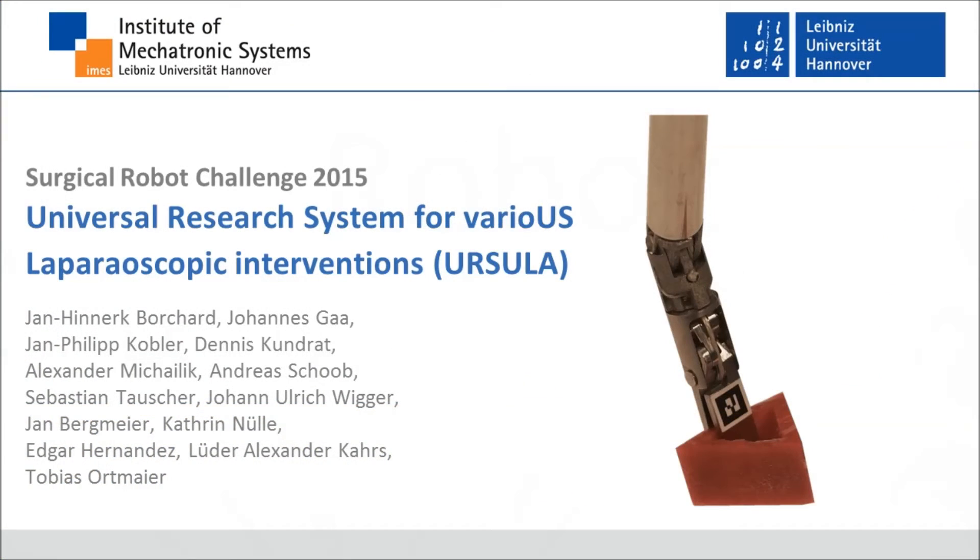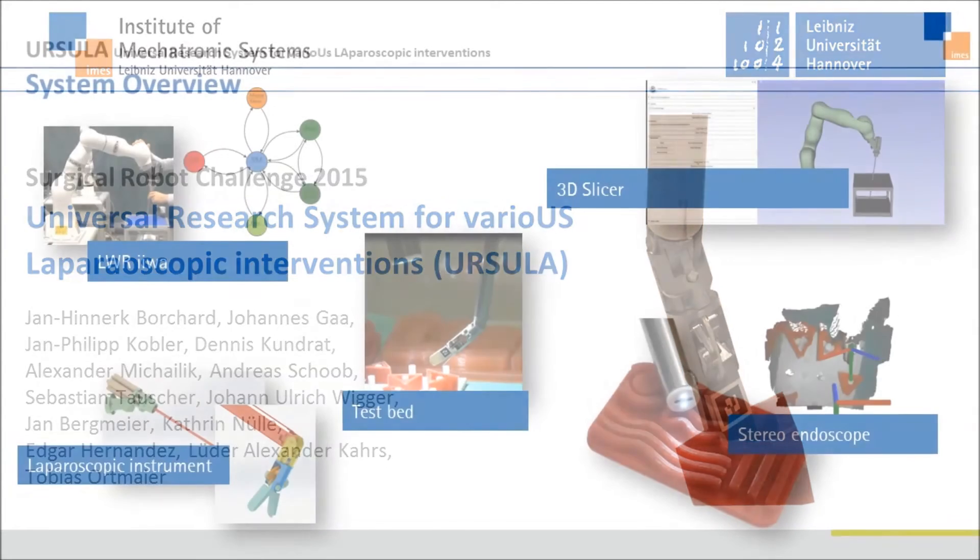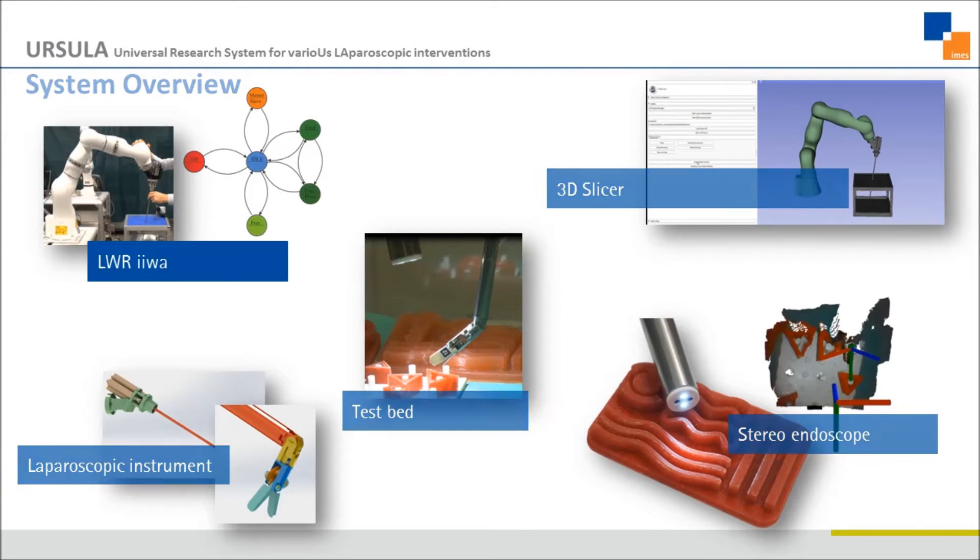Our universal research system for various laparoscopic interventions is called URSULA. We use the KUKA lightweight robot IWA in combination with our self-made components.